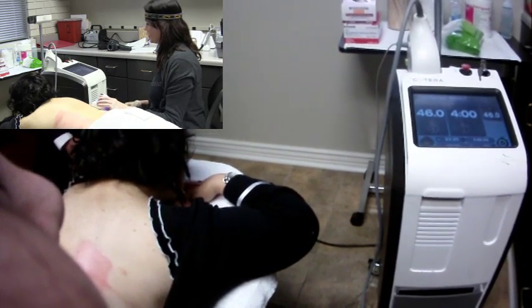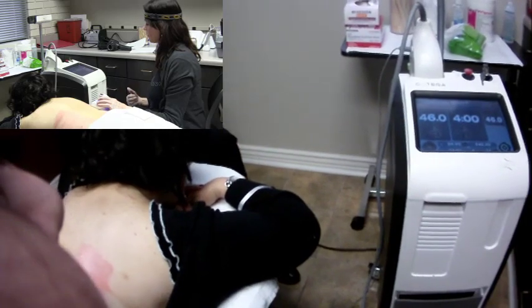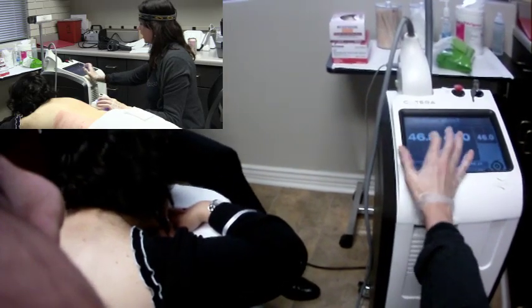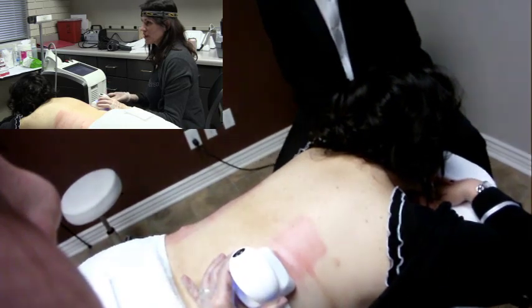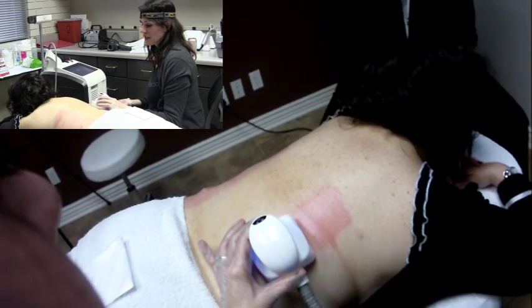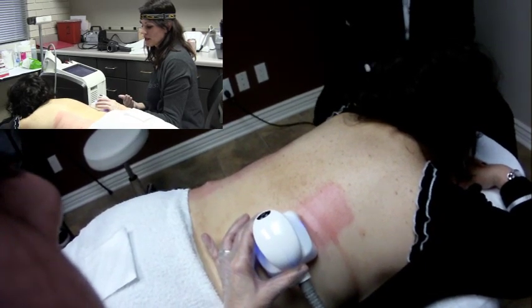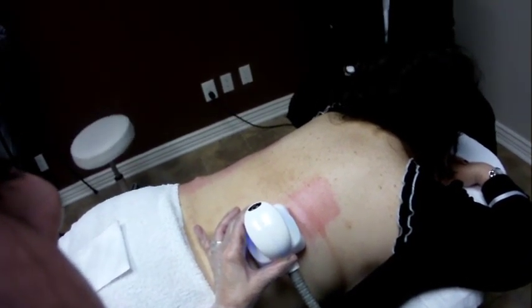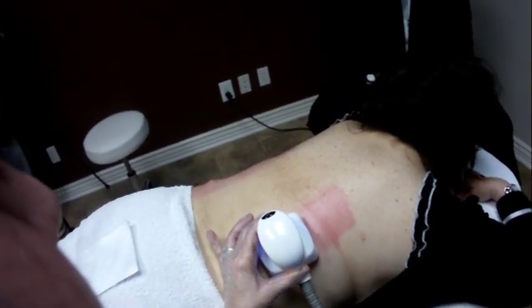I've got my friend from Cutera here with me, so he's going to feed me a little bit of information because this is the first time I've worked with the machine. So this is monopolar radio frequency — what's the depth of penetration? The penetration is about 7 to 15 millimeters. So 7 to 15 millimeters depth of penetration into the adipose tissue, and what we're trying to cause is apoptosis, which is cell death of the fat cells. Then the body takes over and starts to eliminate the fat through your normal waste system and lymphatic system.